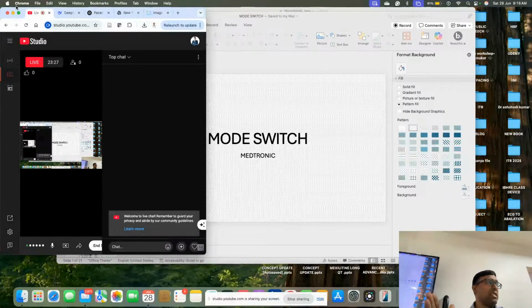Immediately it will change. And with the mode switch, what will happen? The particular rate we want, the ventricle rate. For some patients we will ask the ventricle to pace at 60, somebody at 70, somebody at 80. But nominally, most of the time, it is 80. Yes, sir, 80, because the atrial rate is very fast. All of a sudden, if you go to 60, the patient may have difficulty. So it keeps the rate in and around 80. Most of the companies have 80 or 90 or 70, somewhere between 70 and 90. 80 is the nominal. So it will pace at 80 till it senses, and this is VVI mode.